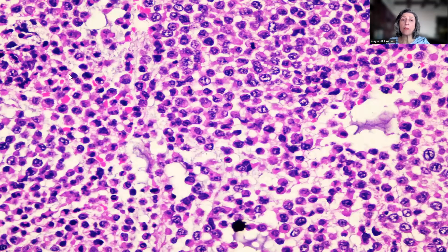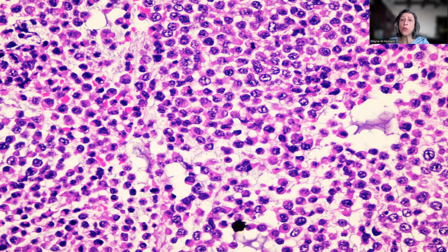Another high-power magnification of the same tumor shows rhabdoid-like cellular features, with cells with abundant acidophilic cytoplasm, eccentric nucleus, growing in a myxoid background. So again, is this lymphoma, plasmacytoma, plasmacytic tumor? Is this rhabdomyosarcoma? Once you start to wonder about this differential diagnosis in the endometrium in an elderly patient, you have always to consider undifferentiated endometrial carcinoma.